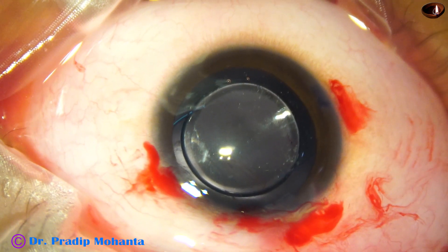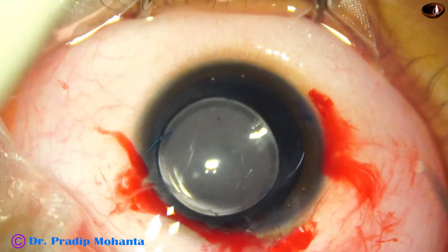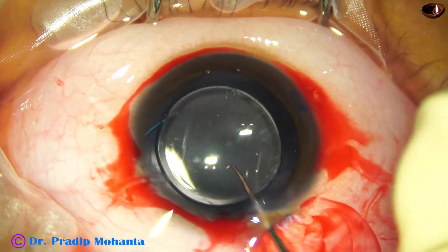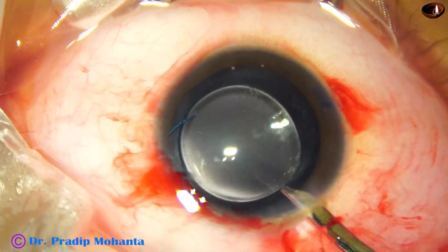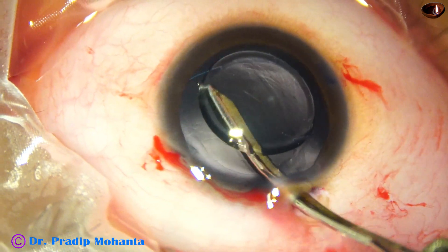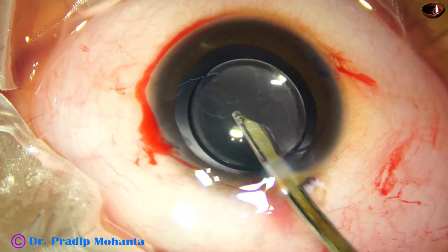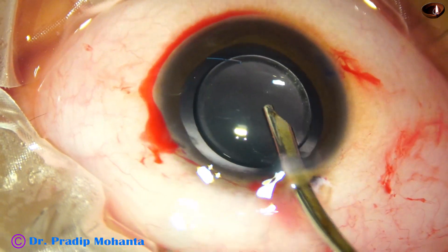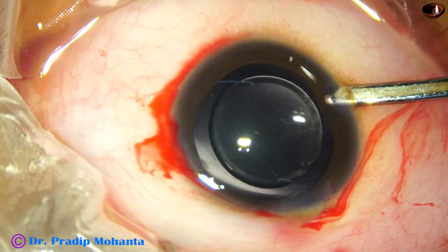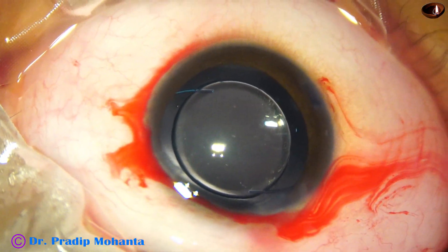I take McPherson's forceps and place the trailing haptic in the capsular bag. Now it is time to clean the visco and then do a posterior capsulectomy. The visco is being cleaned from behind the lens and from in front of the lens. We need not clean all the visco at this stage because a lot of things are still to be done. Most of the visco has come out, but many visco molecules are still there in the capsular bag and anterior chamber.